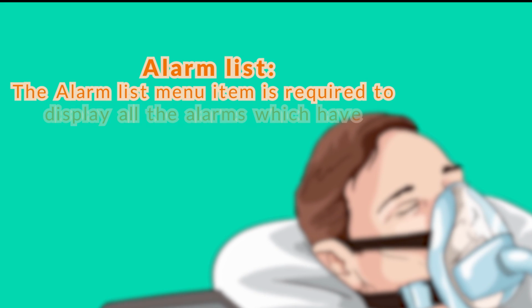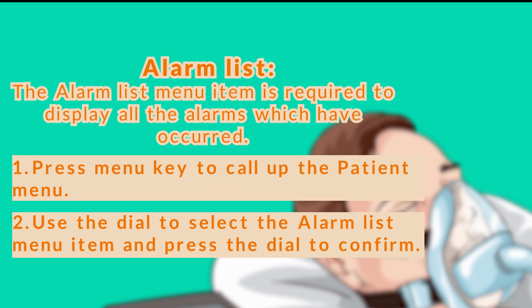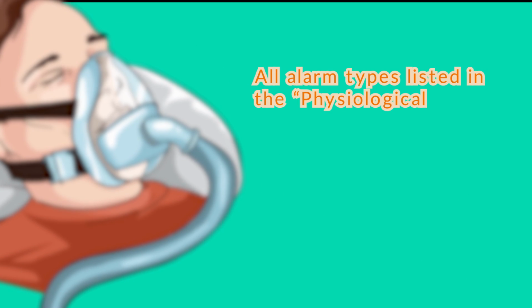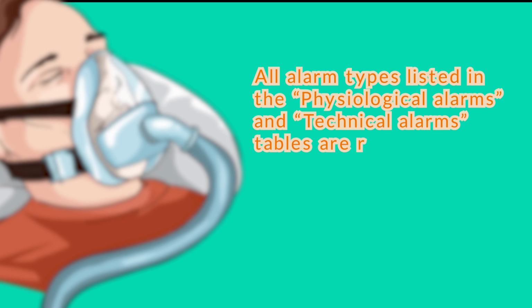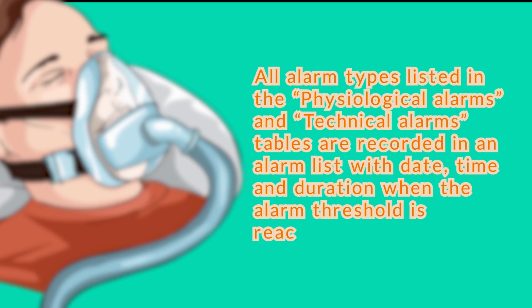Alarm list. The alarm list menu item is required to display all the alarms which have occurred. 1. Press menu key to call up the patient menu. 2. Use the dial to select the alarm list menu item and press the dial to confirm. All alarm types listed in the physiological alarms and technical alarms tables are recorded in an alarm list with date, time, and duration when the alarm threshold is reached.